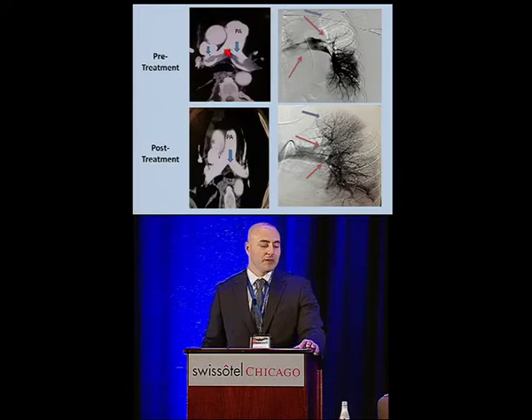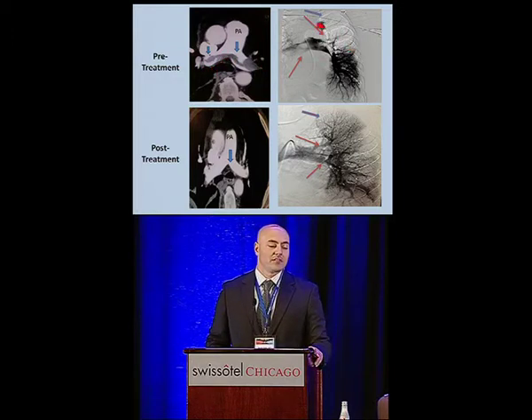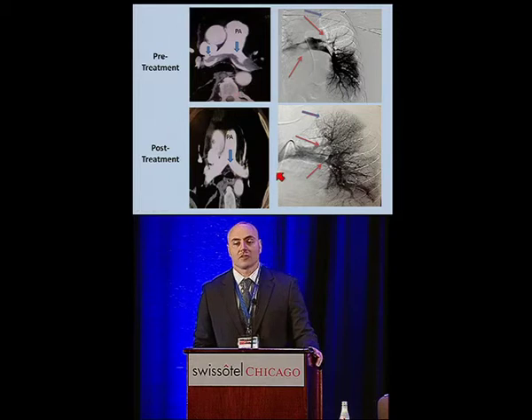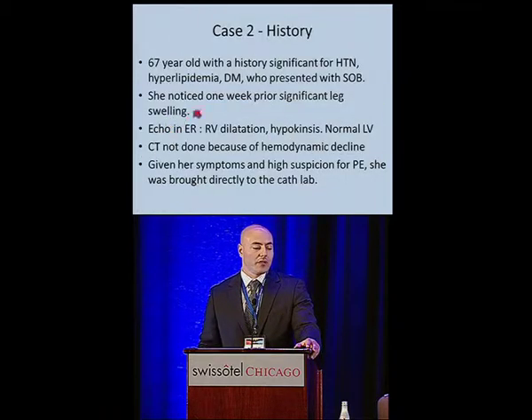And so pre-treatment, this is a CT scan of that saddle embolism, and this is a static image as well of the clot burden. And then we see post-treatment 2 days later that the thrombus, the saddle embolism, is gone. There's some remnants of thrombus, but it was enough for us to stabilize the patient and subsequently just put him on oral anticoagulation.